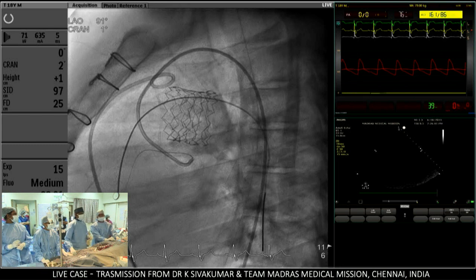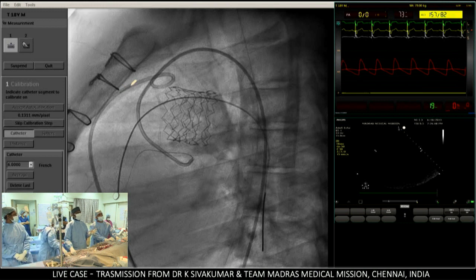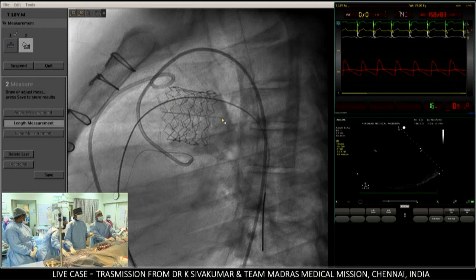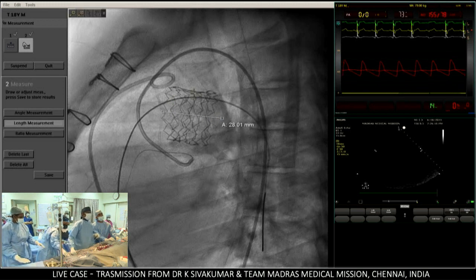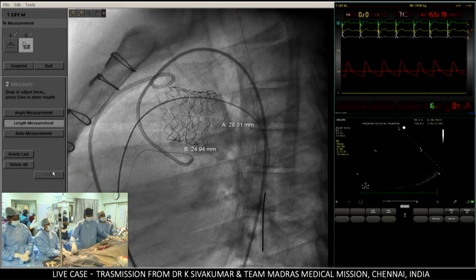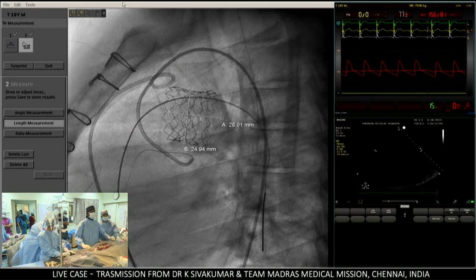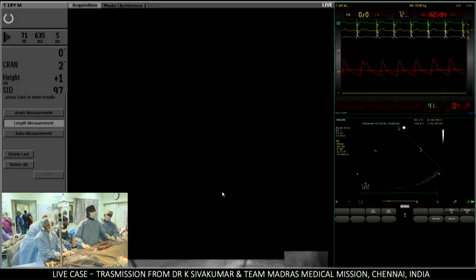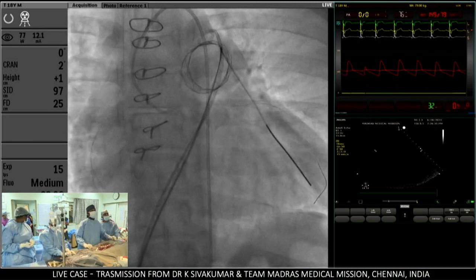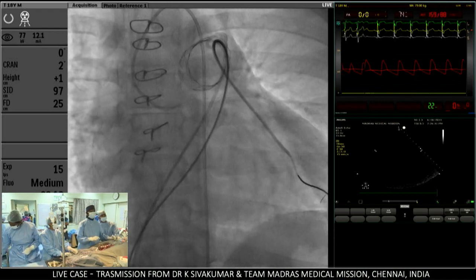No shortening. This is because the distal part and the proximal part were all roomy, so when we put in a larger and larger balloon, it actually shortens. It dog bones. In my previous procedure, I had used a Coda balloon to flare out the edges. In true blood vessels such as coarctation, there will not be. Actually, this 28 is overestimated. I would say 25 or 26 should be the correct size. Whether it dog bones or not, it shortens. Okay, agree. So carry on with the next bit. I don't want to delay you too much.